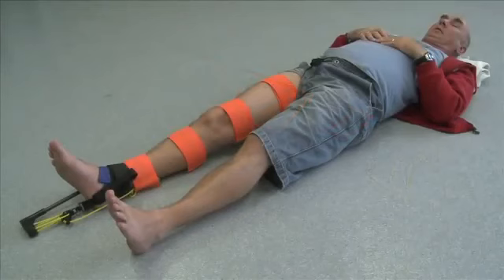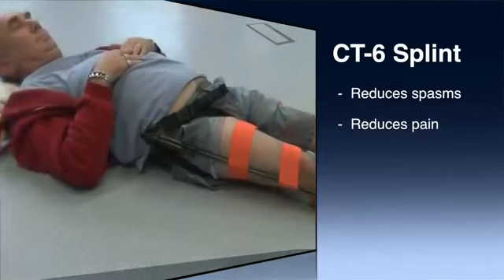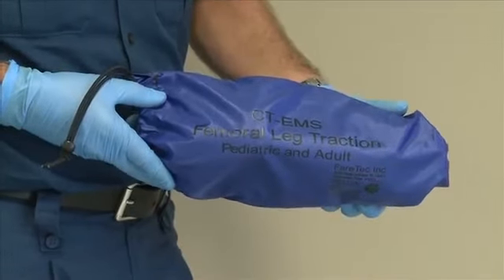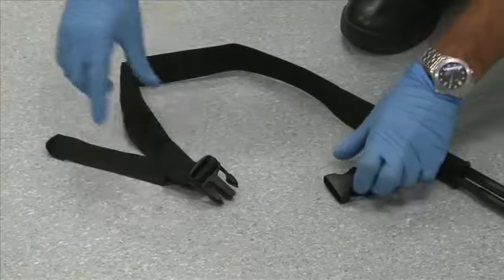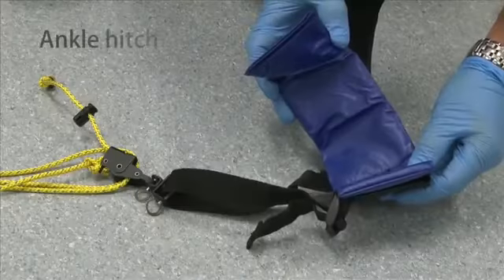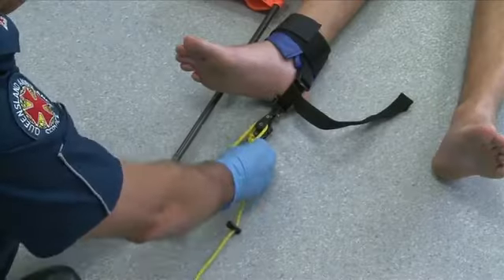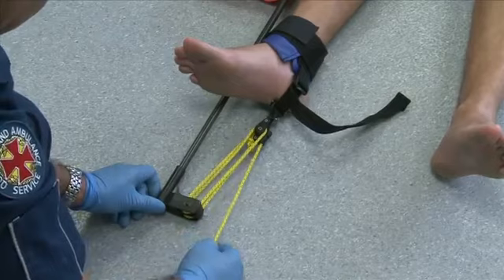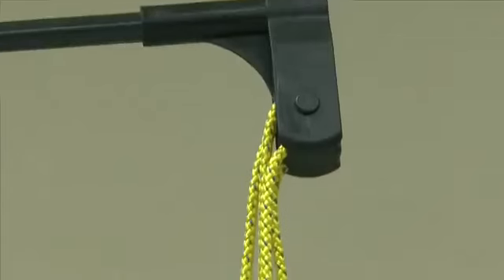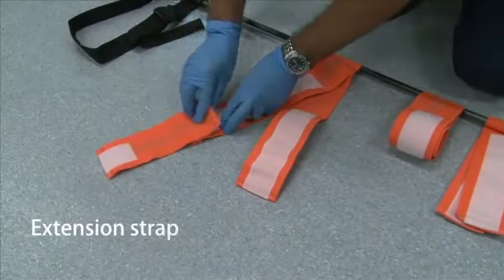The CT6 is a traction splint that aligns and immobilises femoral fractures. The splint reduces muscle spasms, pain and helps prevent blood loss and any further damage to anatomical structures. The splint comes complete in a small kit bag, making it easy to store and transport. The CT6 uses an adjustable ischial strap around the upper thigh. This is the ankle hitch, consisting of the ankle strap, the foot strap and the safety clip, used to hold the foot in place while traction is applied. The splint assembly comprises a multi-linked tubular frame, leg straps, and the tension-adjusting block and line mechanism. The extension strap is used to lengthen the upper thigh strap for larger patients.